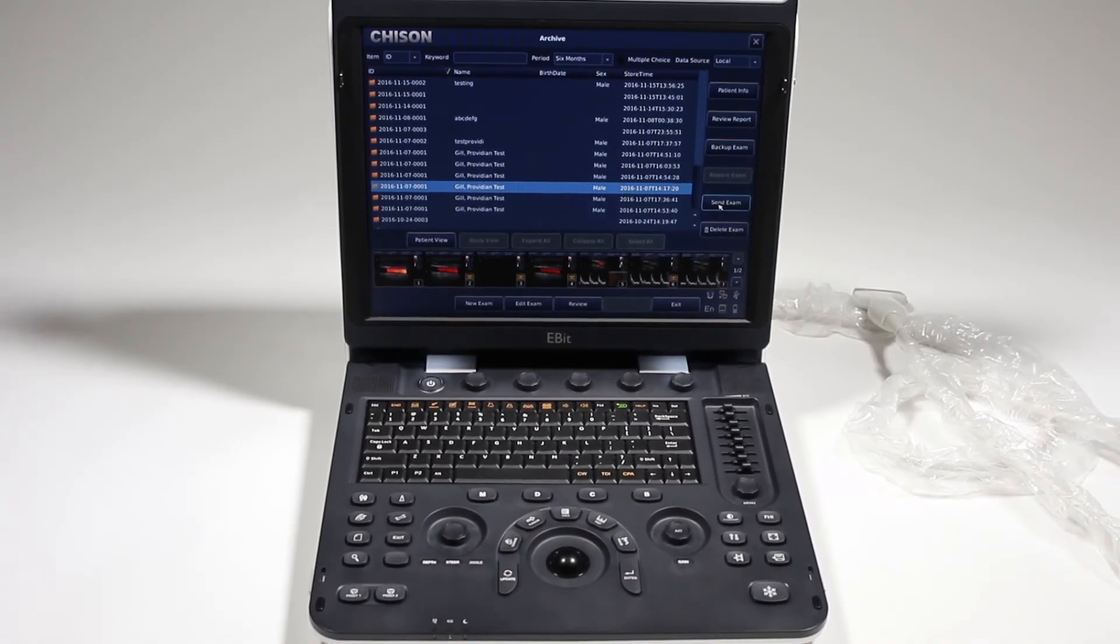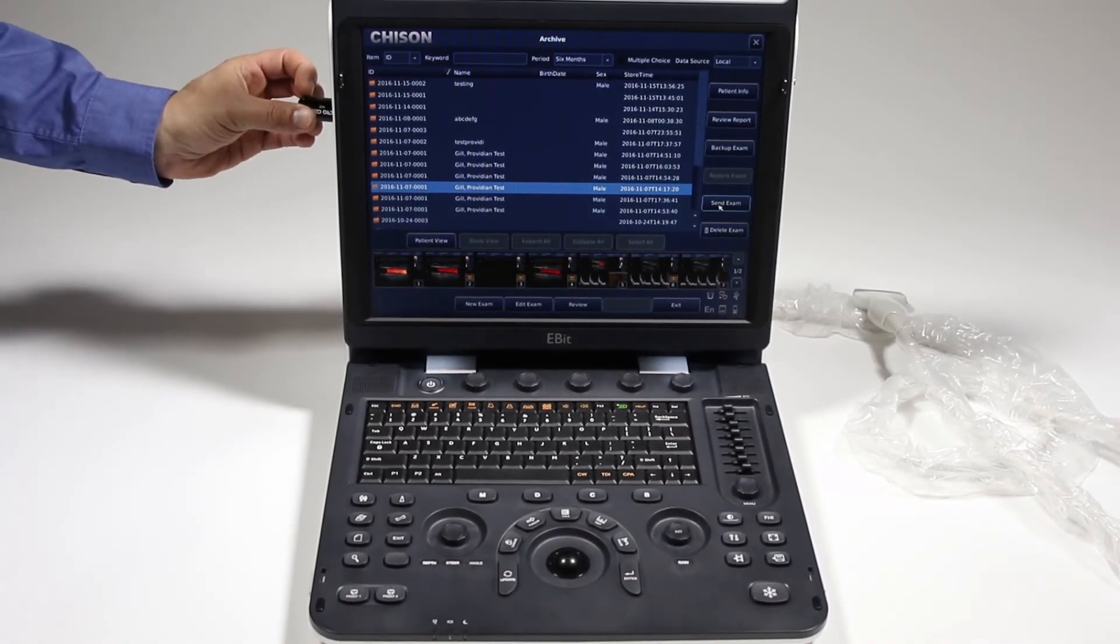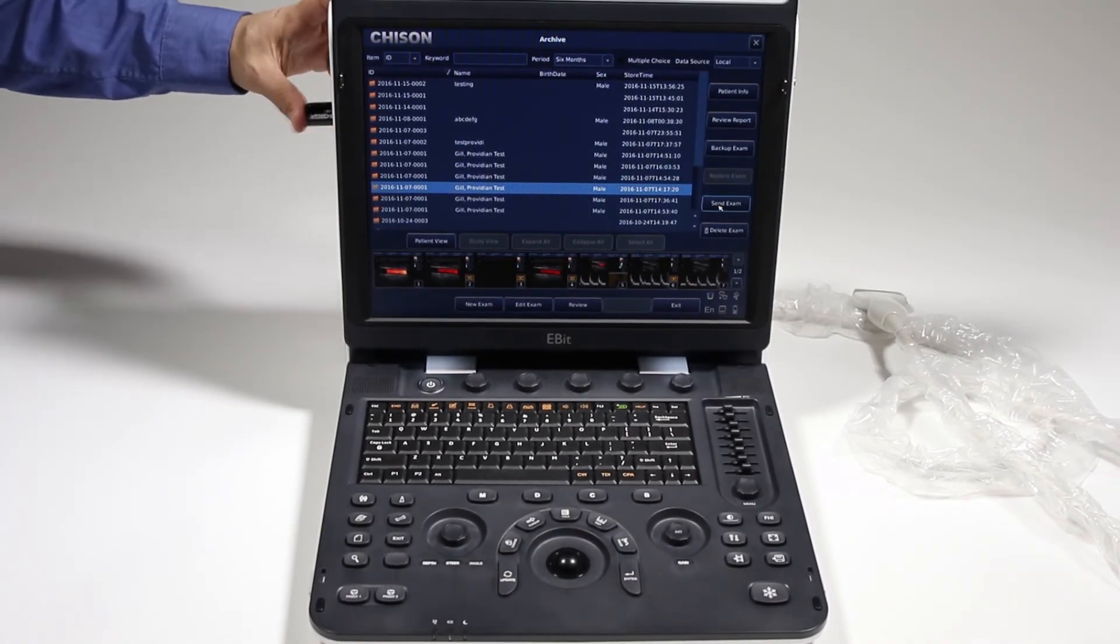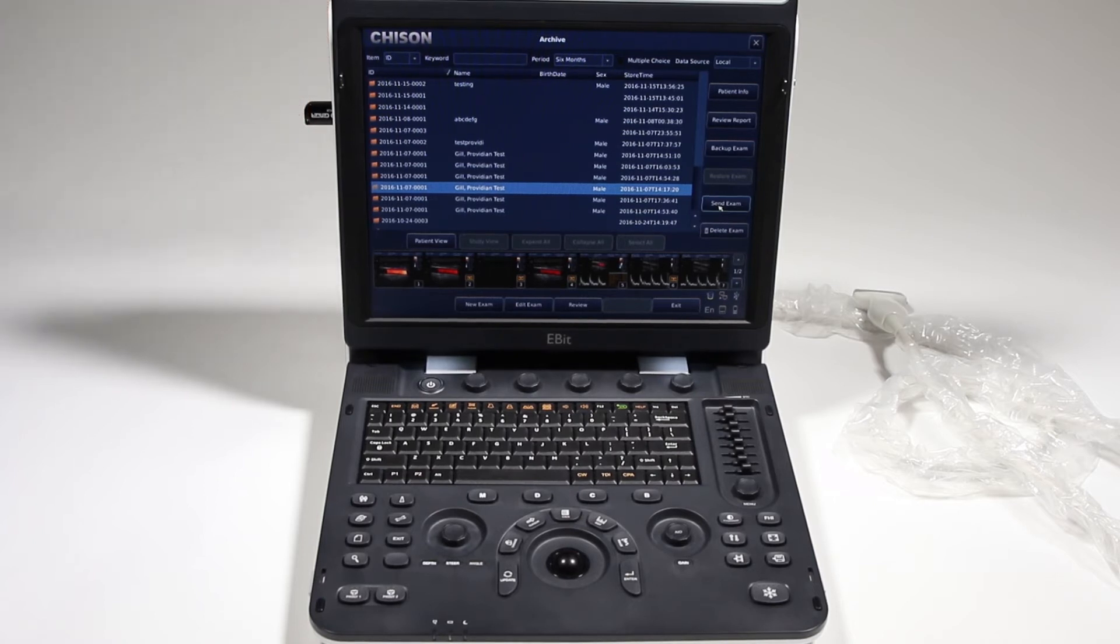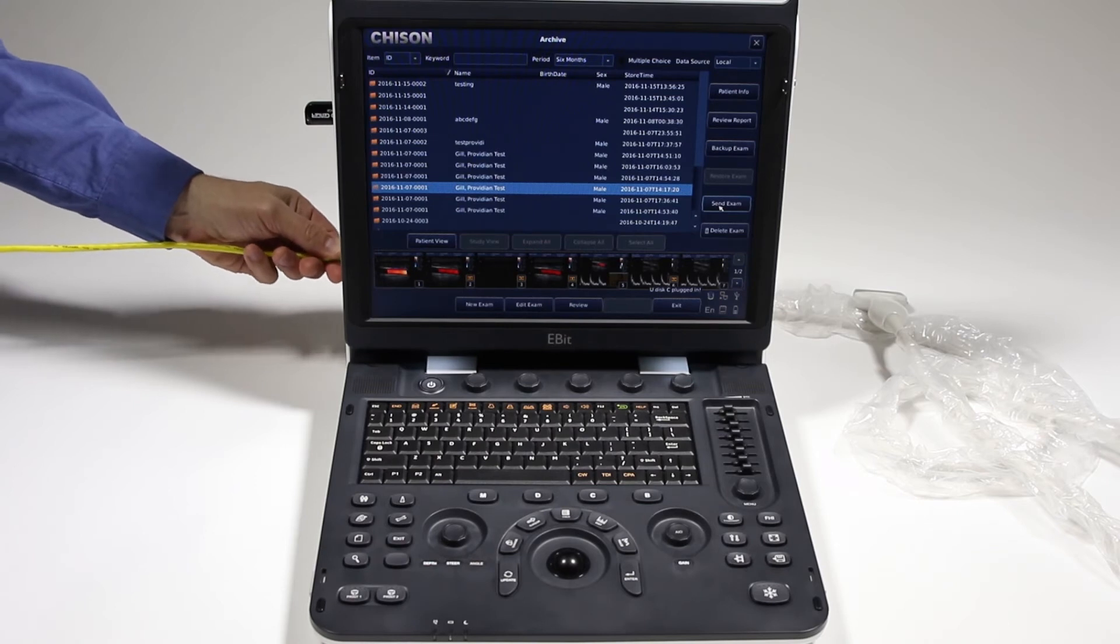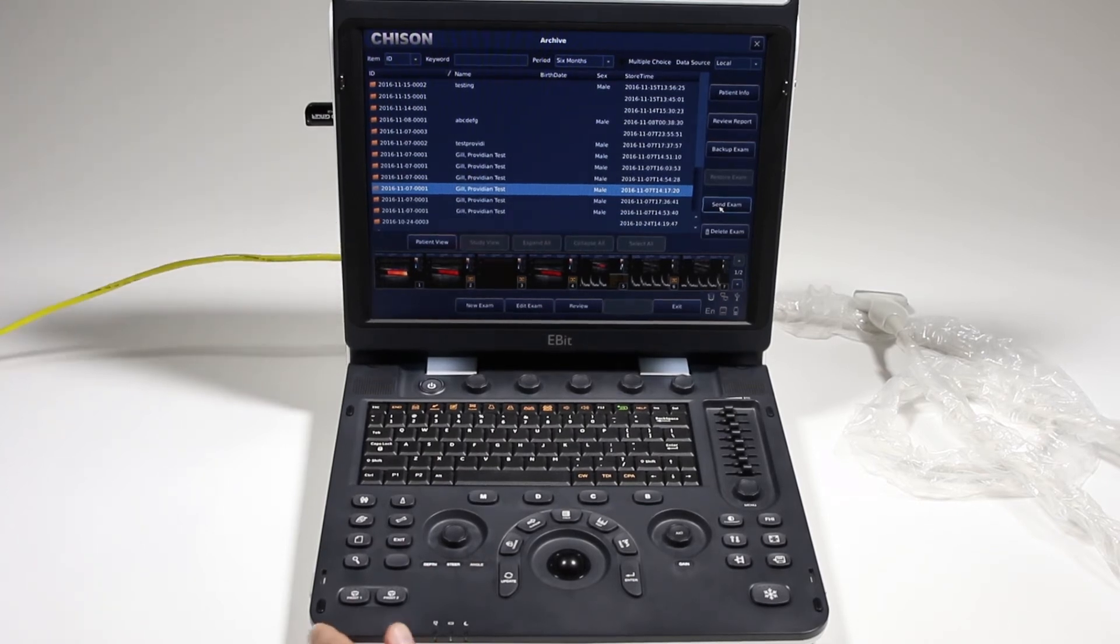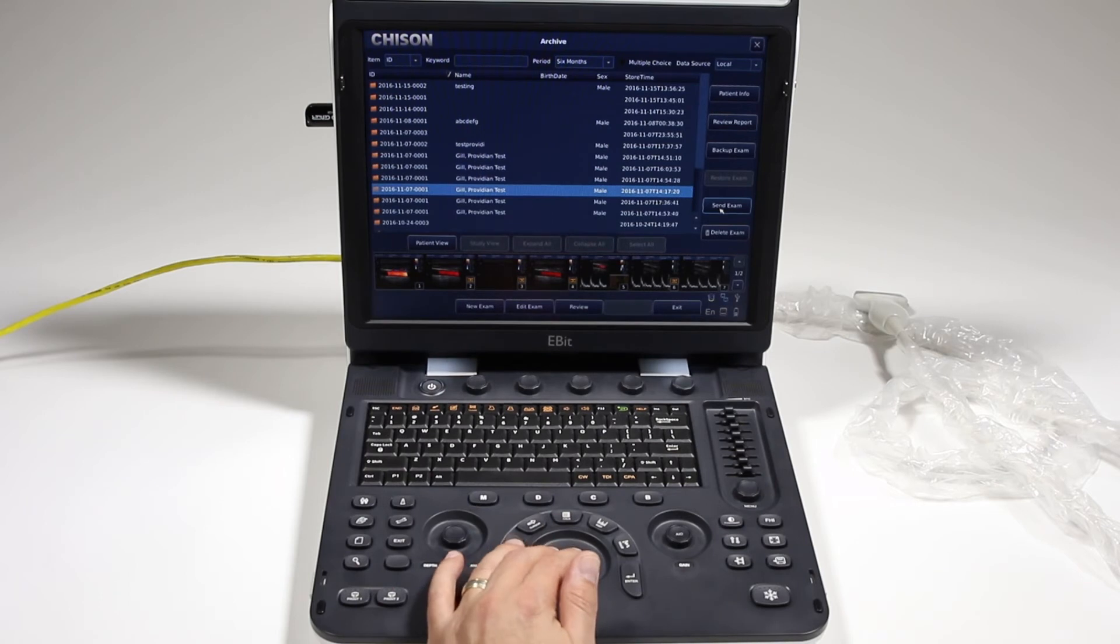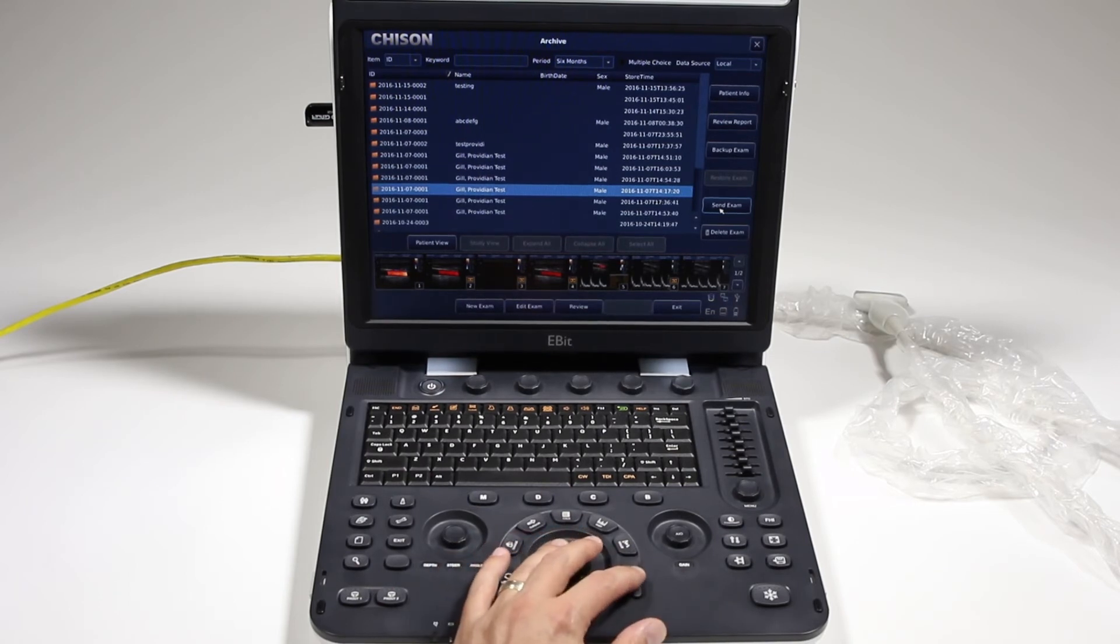I'm going to start by plugging in my USB stick. At the same time, I'm going to go ahead and connect it to a network. So now that I've connected it to the network and a USB stick, I'm going to show how to send both.